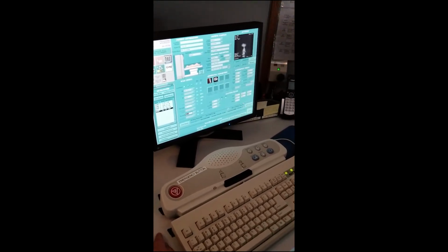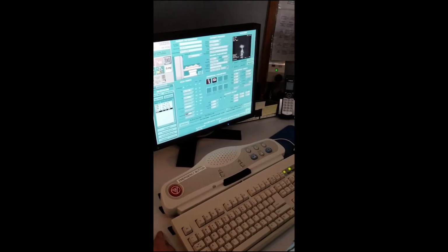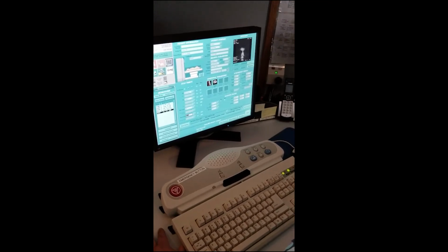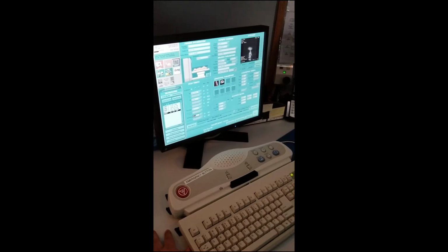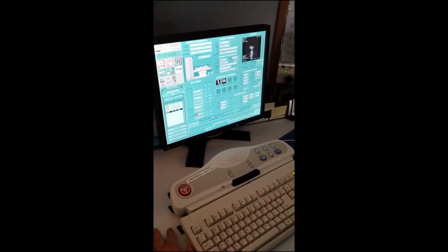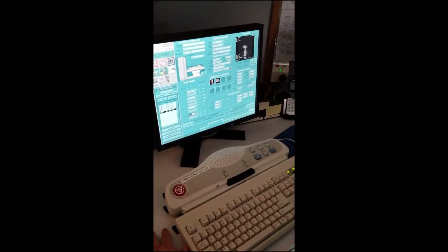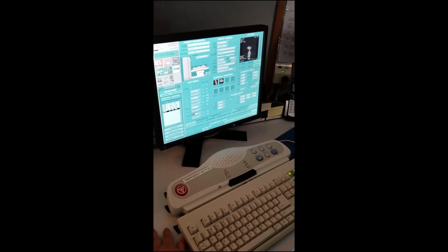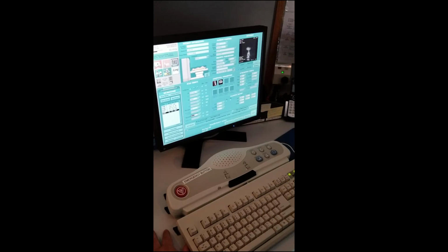Now how many slices is it giving you? 26 slices, 31 acquisitions. Do I need all the 33? No. But I don't want to keep going down, because if I go down, it's going to be maybe a TR of 200, and 200 is way too short on this system. Image quality is not going to be that good. 400 is sufficient. Minimum is 400, so I don't need to match. It doesn't need to match. Okay, so everything looks good.